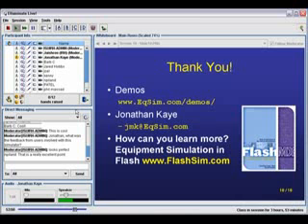Complex things take a lot of time to build. The Avita 4 simulator took 3 or 4 months, almost twice the amount of time that the other one did. And again, better planning in terms of the specific skills and the measurement could have cut that time down by at least 50%. Especially, learning software design methodologies has a huge impact on the amount of time and resources needed to build simulators.